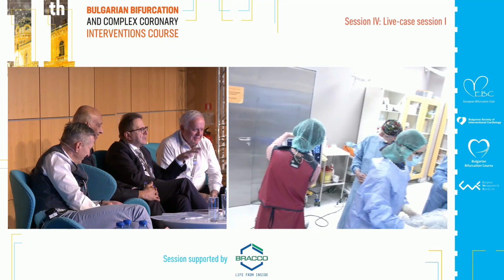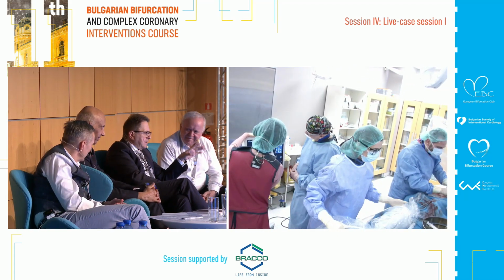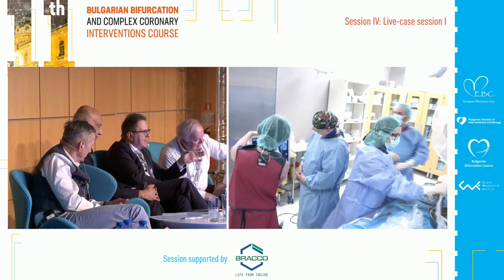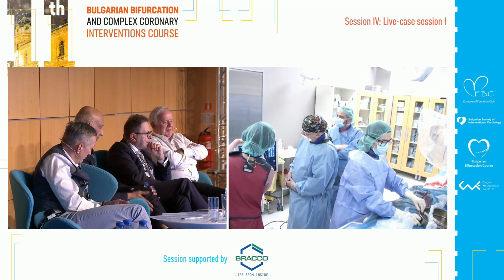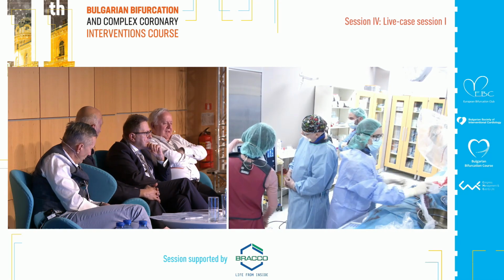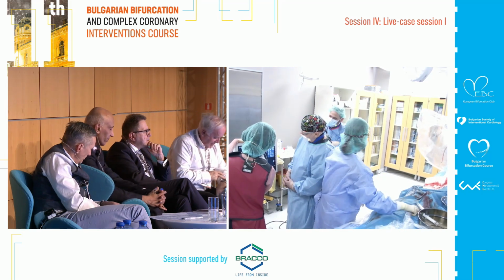But there was not optimal position. What is the minimum stented area of the distal part of the left main? Let's say left main, just before the circumflex orifice. Are you talking about the left main minimum stent area? Show us, which is going to be, I'm a little bit generous. We are checking the IVUS for you. But 7.2.